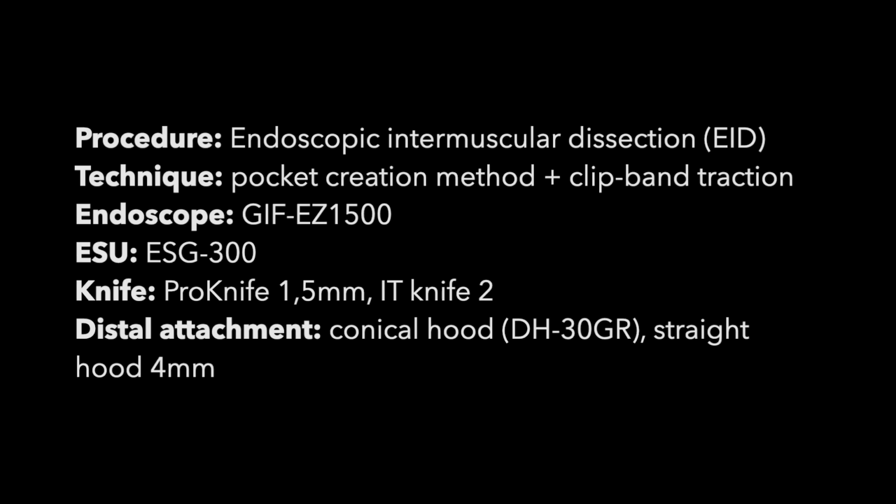The patient was scheduled for EID with curative intent, but failing that, it would at least provide definitive staging. Now, I imagine some of you will be wondering why we didn't go for TAMIS or TME, so I'll come back to that question as we go through the procedure.